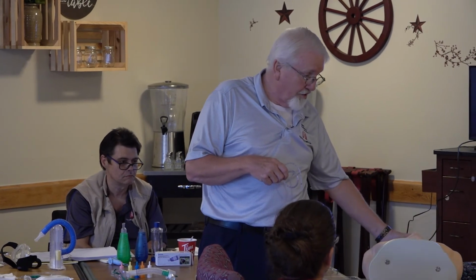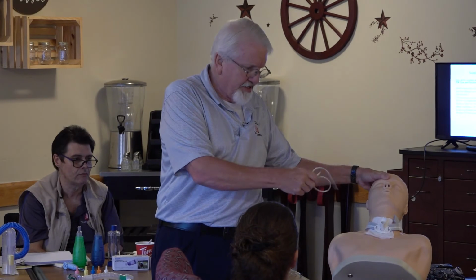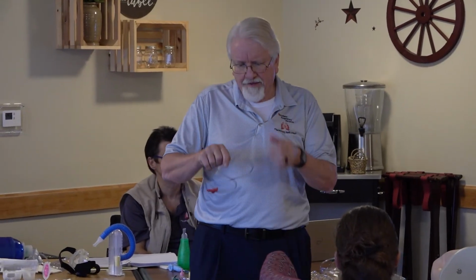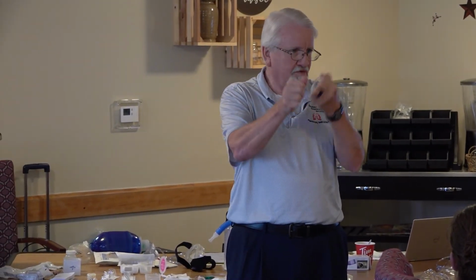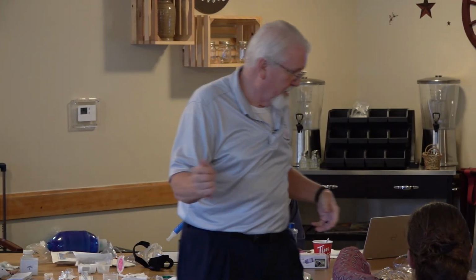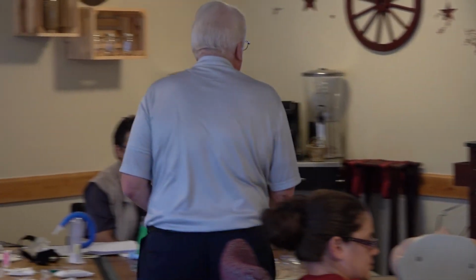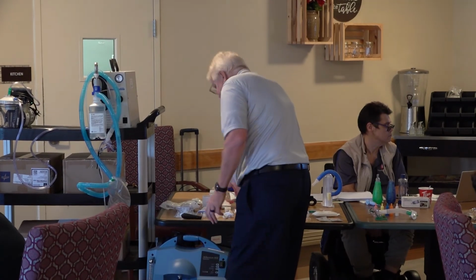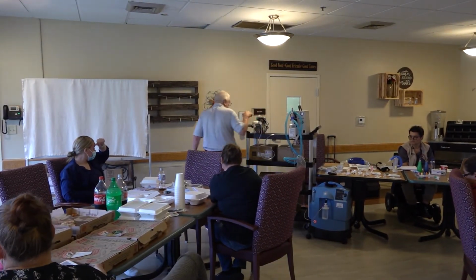I'm all done. I've got all my stuff that I'm going to document. Make sure Bob's back up to comfortable. I didn't have to lower him down to do that. He's going to be at the 35 degrees. When I get all done, I'm going to double glove this. So 1, 2, and then I'll discard. Everybody cool on the documentation and everything for suctioning?